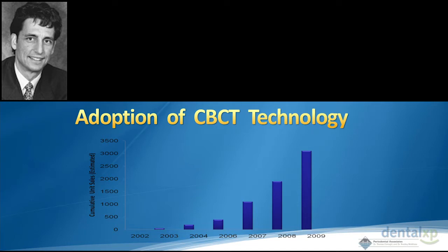The problem is there's still a tremendous number of implants being placed today in key anatomic areas or in aesthetic zones where the CBCT is not being utilized for preoperative planning, nor is it being utilized to evaluate your postoperative results. As Danny mentioned earlier, 5% of those cases will not have a buccal plate, even when done by an excellent clinician and using excellent graft materials. And what that means is we'd like to know which patients they are so that we can plan accordingly and make sure that we're monitoring those patients carefully, and we can give them options as far as supplemental grafting.